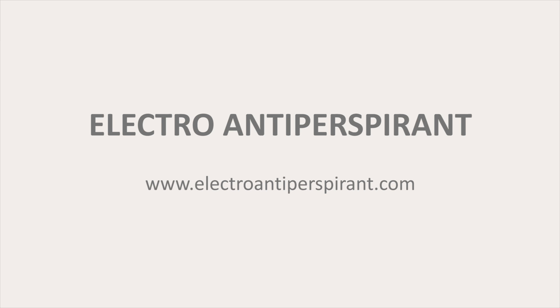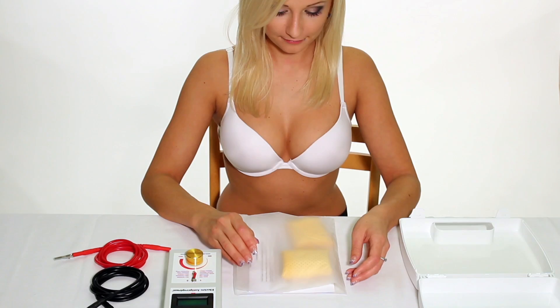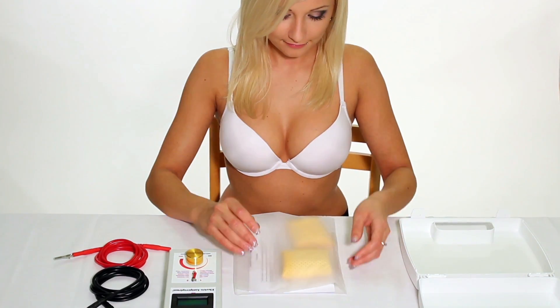We present the most successful solution to excessive sweating in armpits: comfortable armpit adapters to electroantiperspirant device.